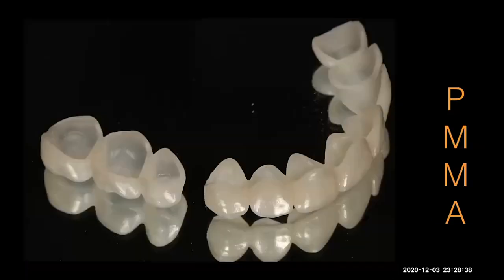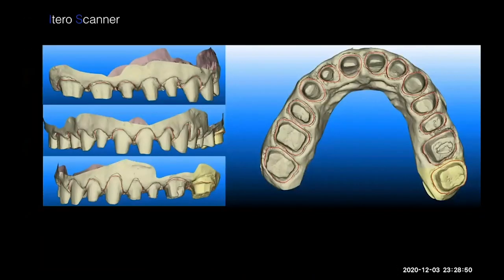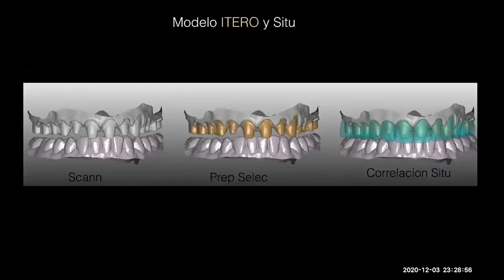And then once we cement the lower crowns, we go to the upper arch and start to develop our final restoration. We place our PMMA. Then the doctor reprepares and takes the intraoral impression with the iTero scanner.